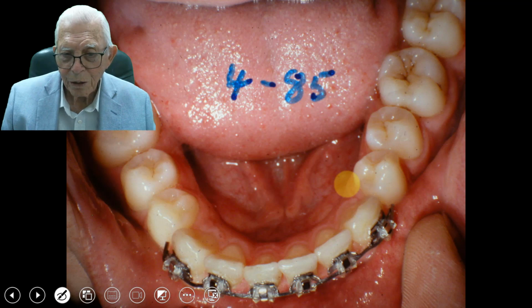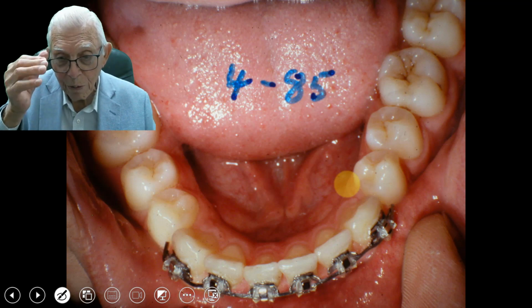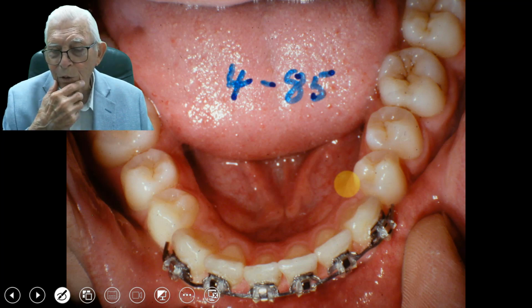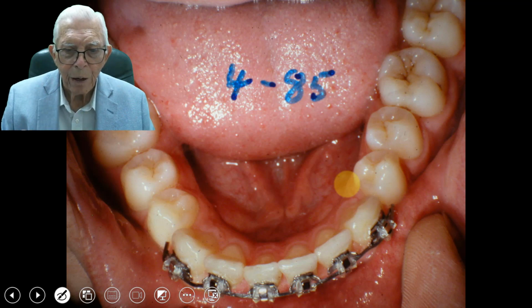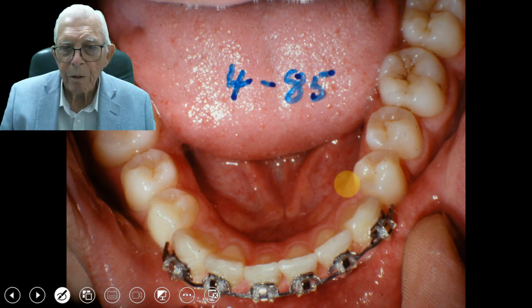So this is a Class 2 Division 2 case. That's a lot more complicated than some of these others that we showed you, but you can do it. If I can do it, you can see it done. And so you can do this, advance the mandible. And we've done that on a lot of TMJ cases where we advance the mandible and get the condyle away from that retrodiscal tissue back here.